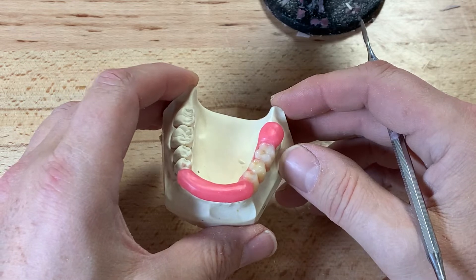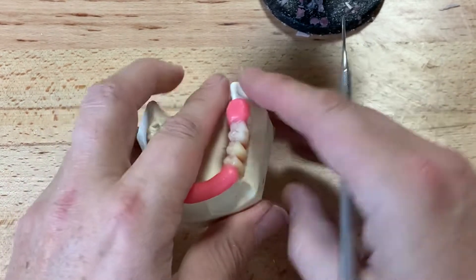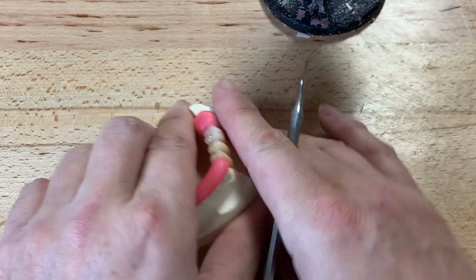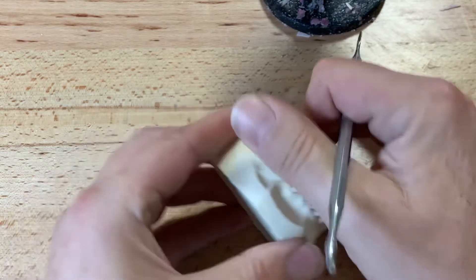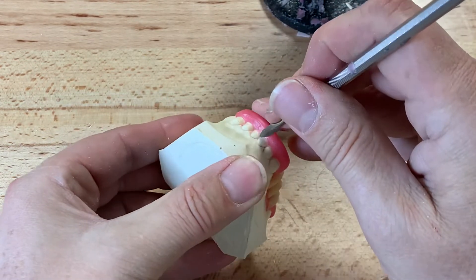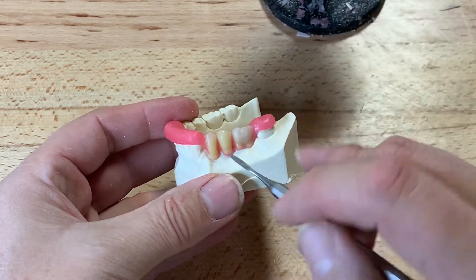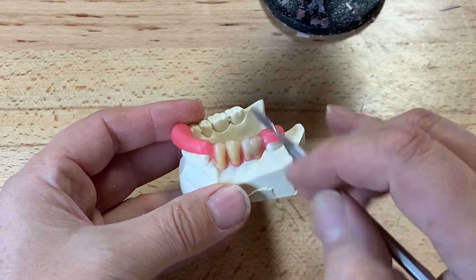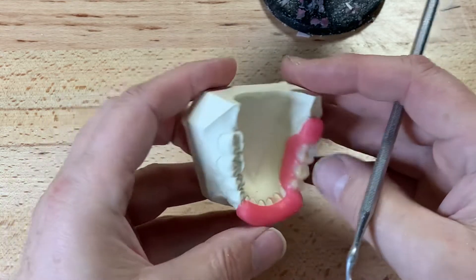We could use the IvoBase injection or sprinkle technique, but I would build up some walls before sprinkling clear ortho resin. I've created a little extra thickness so that deflasking won't fracture it. Keep in mind the very critical areas are the connectors between six and seven, and four and three — these connectors have to be thick enough.